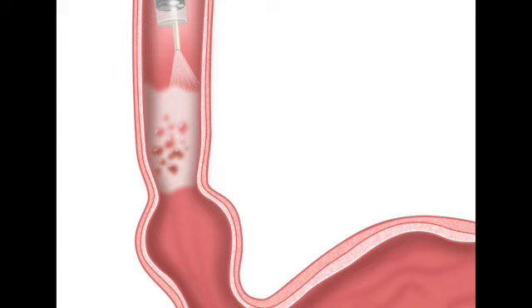But then you step away from the bones and into the world of gastrointestinal medicine. Oh, yeah. That is a whole different ballgame. It really is. Specifically, when doctors are looking for subtle, hidden precancerous cells inside your digestive tract, suddenly that crisp X-ray certainty is just gone. It's completely gone. You're looking at a diagnostic landscape that is incredibly murky. Yeah, because you're navigating through tissue that, to the naked eye, all looks roughly the same fleshy pink color, right? Even through a state-of-the-art camera.